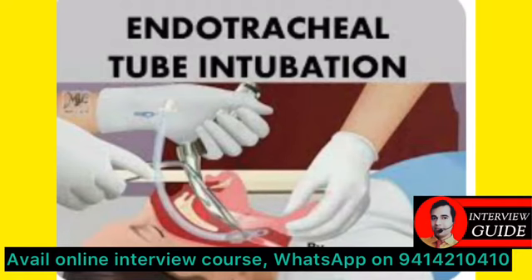Intubation requires some prerequisite equipment, which includes the endotracheal tube. It is mostly used for adult males in size 8 to 9 millimeter, and for females, the size is 7 to 7.5 millimeter. We also require a laryngoscope with a working light, which is very important.